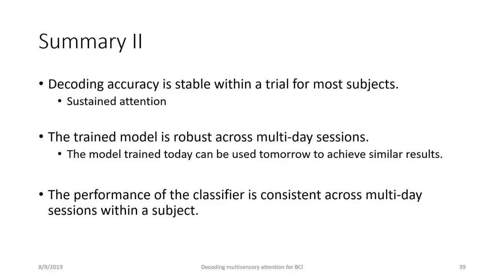So here's the summary of this section. The decoding accuracy tends to be stable throughout the whole trial, so people are paying attention throughout the whole 4 seconds. The model that we trained within one session could be used in a multi-day visit. And also the performance of the classifier is consistent across days within each subject.